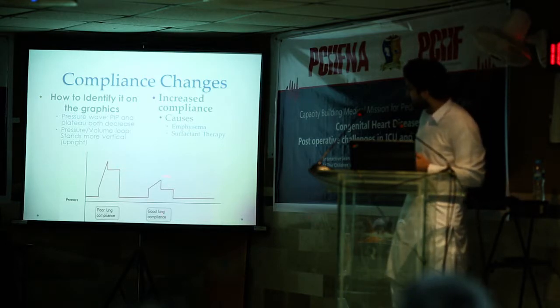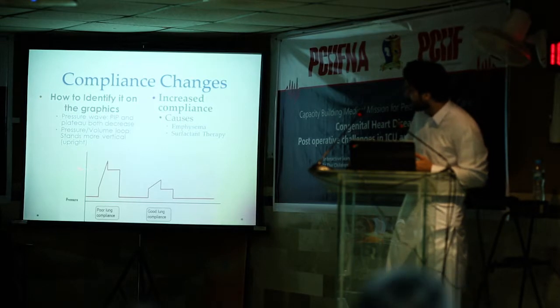This is a normal one, good lung compliance. See, the plateau pressure is normal here. Here, the plateau pressure is very high. So that requires high pressure to get the volume.